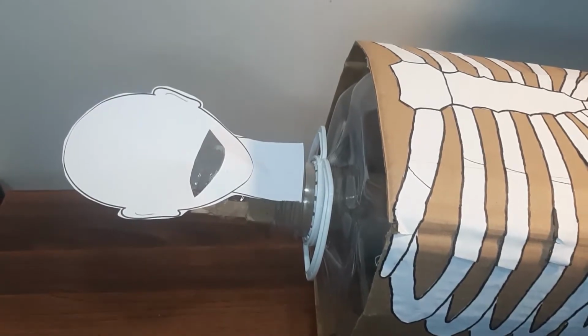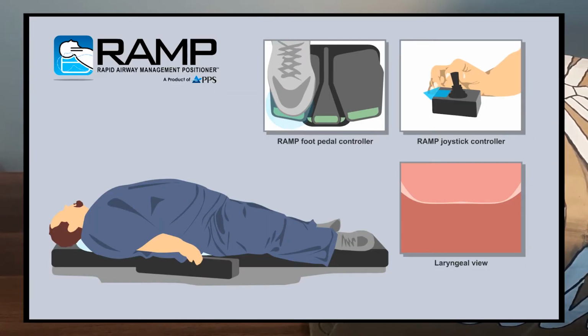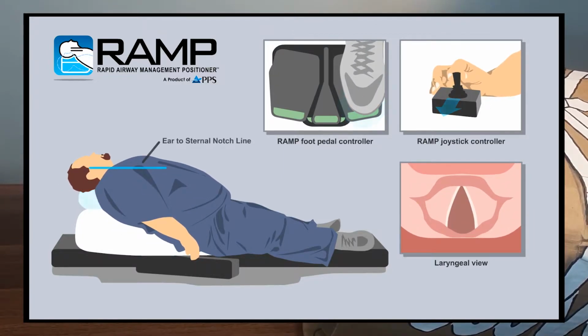Because the patient is obese, expect a potential difficult intubation and difficult mask ventilation. Then appropriately position the patient. For obese patients, place the patient in a ramped or semi-sitting position. This is to provide better view of the vocal cords.